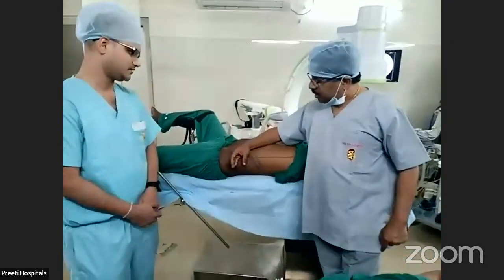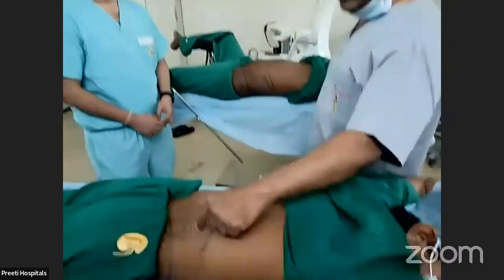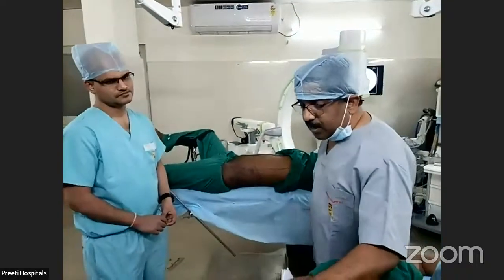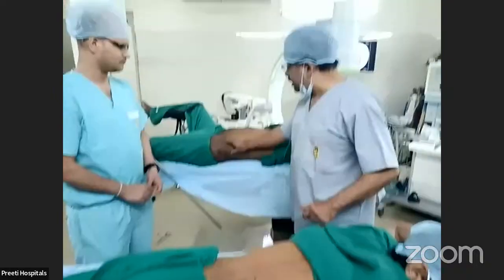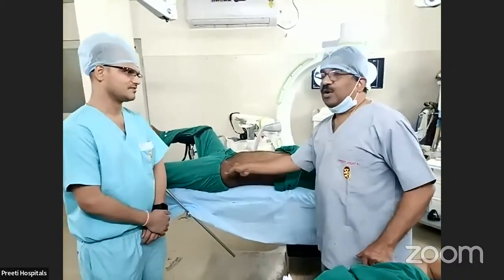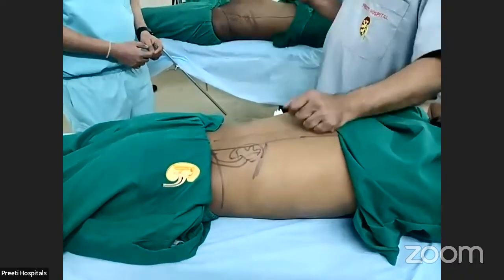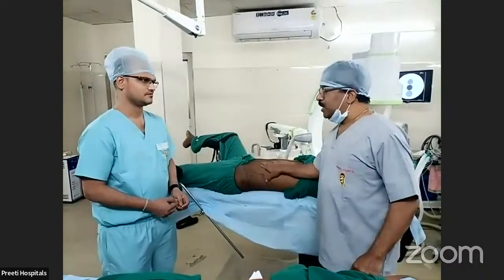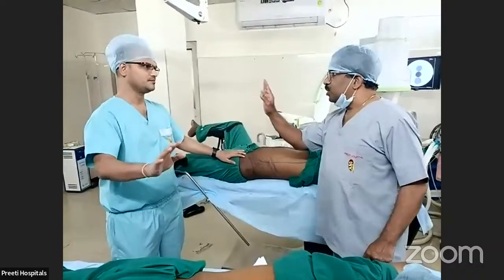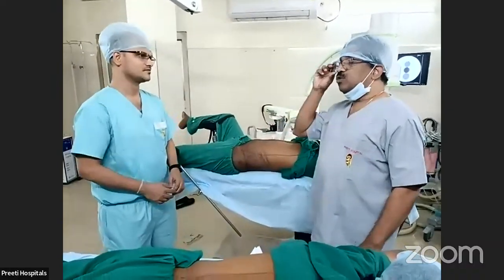Here, if the calyx is directed laterally, then it is easy. Here, if the calyx is a little bit below the 12th rib, it is easy. So here, if the kidney is down, it is easy. Here, if the kidney is up, it is easy. If the kidney is up, in supine PCNL the lower calyx is punctured. If the kidney is down, the superior calyx is there. So that also we have to see. In RGP, if the kidney is very low and the inferior calyx is coming onto the iliac crest, you should not do supine; you should choose prone.